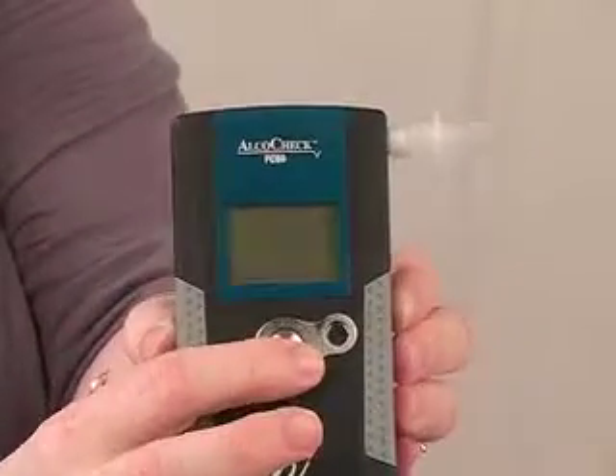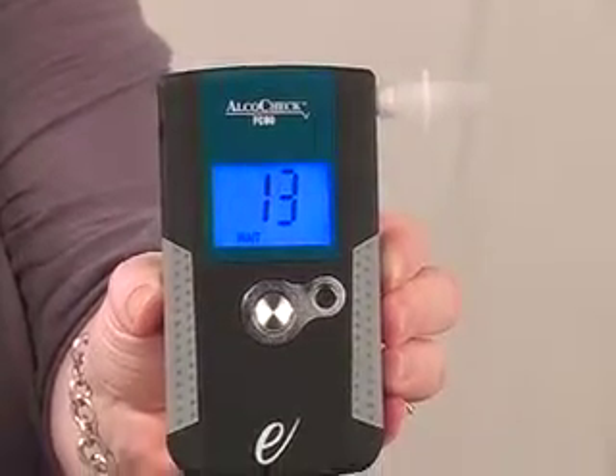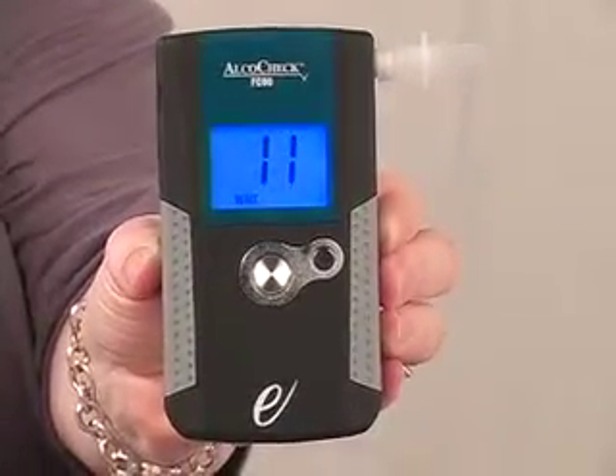FC 90 Procedure. Insert the mouthpiece into the blow hole. Press the large button to turn on the device.